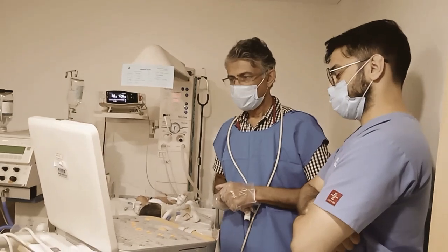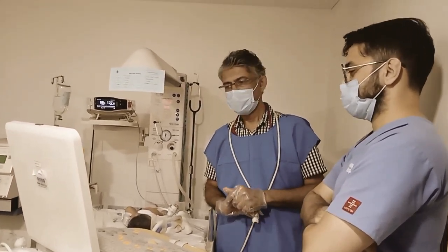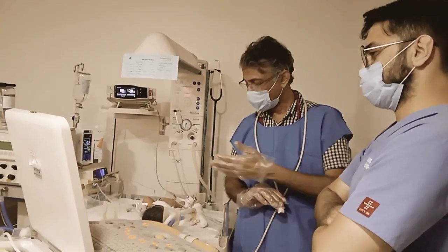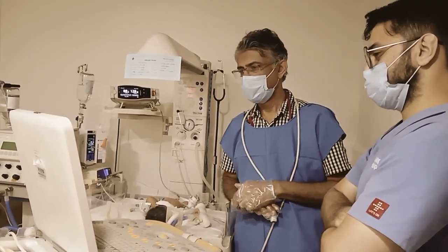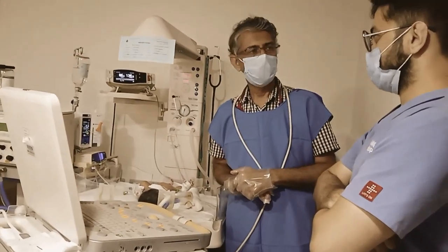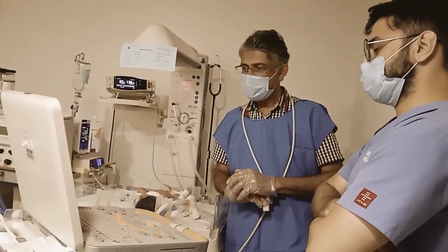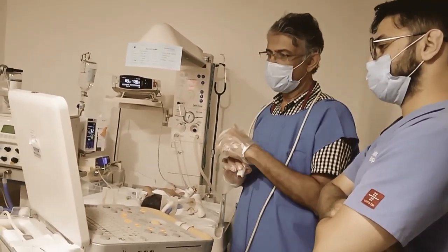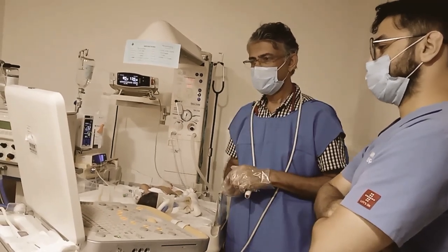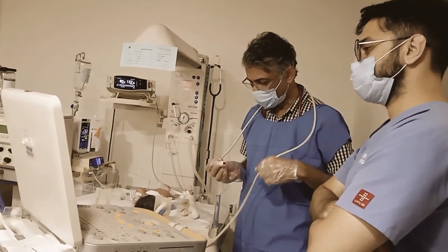Echocardiography is the gold standard in the diagnosis of congenital heart disease, especially critical congenital heart disease. I'll teach you and show you the important echo features of hypoplastic left heart syndrome.